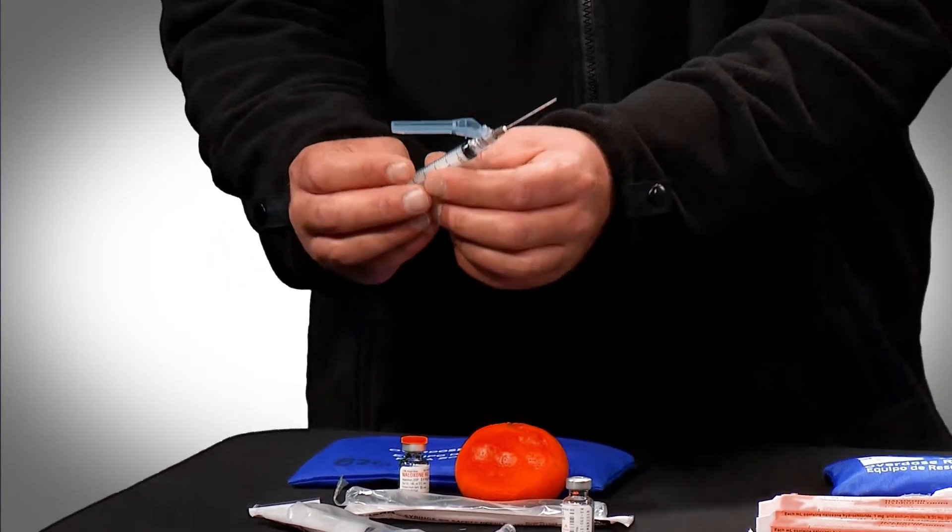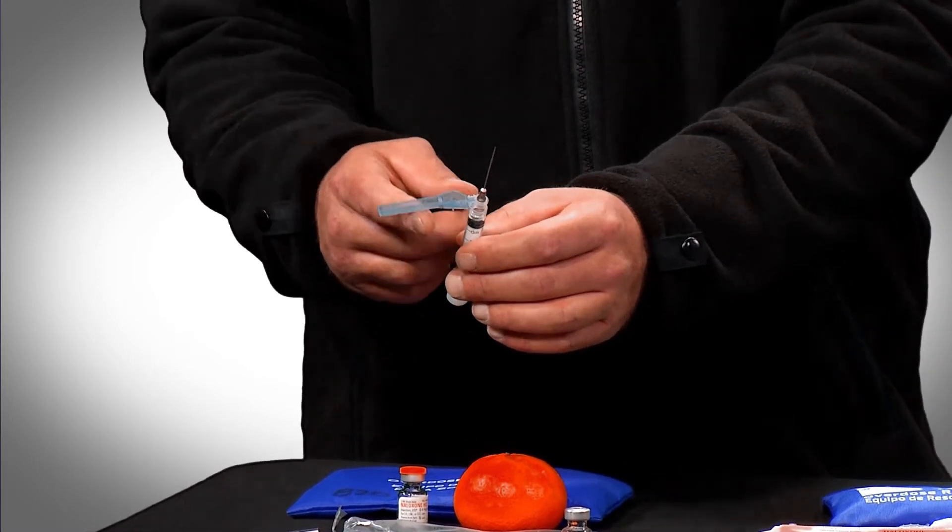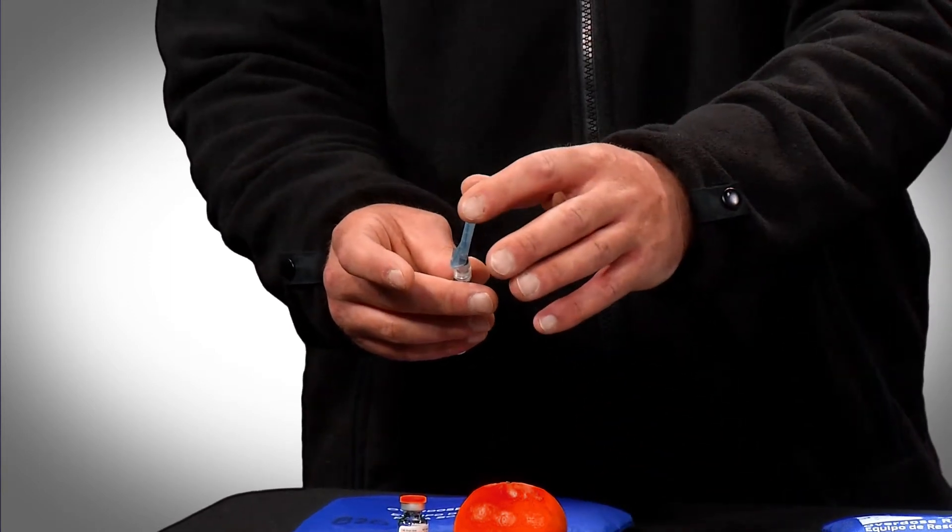Once you've administered Narcan in this formulation, you would then assume that the tip of that needle is contaminated with an infectious disease. That's what this guard is here for. You could either just push it closed and click it, and that protects it from poking somebody.